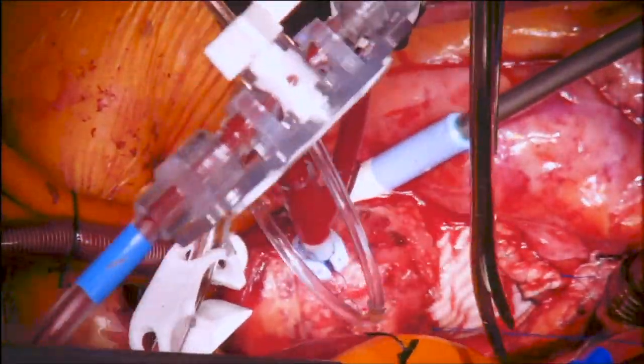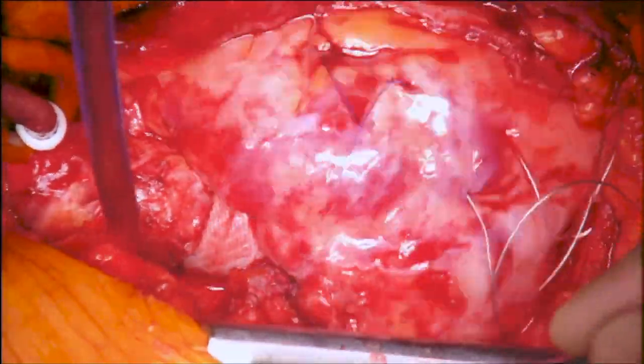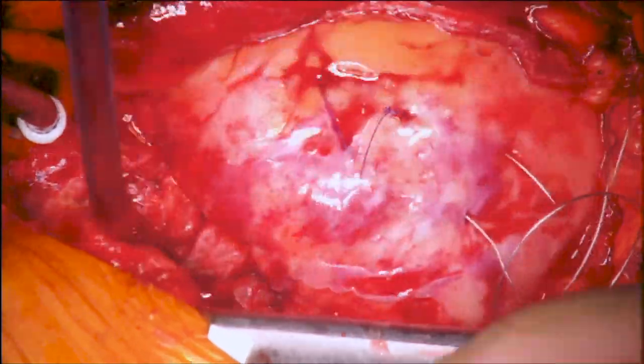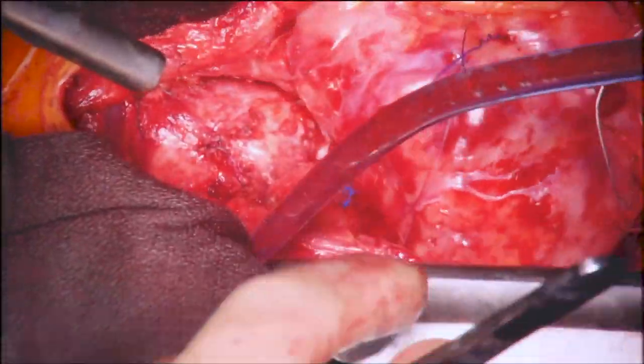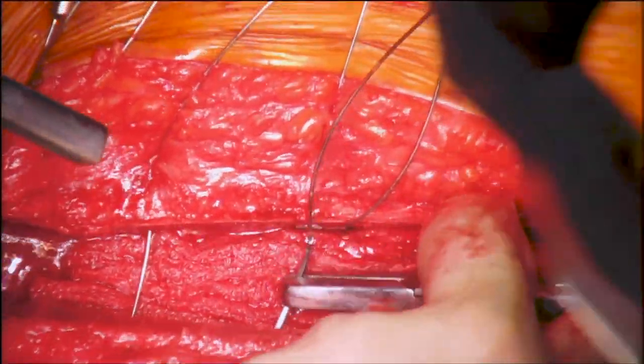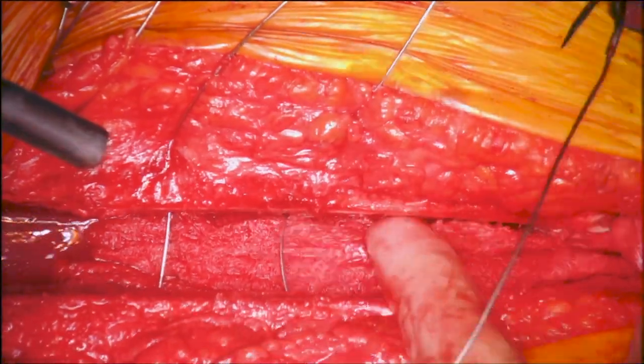After de-airing, the cross-clamp was removed. The patient was weaned from cardiopulmonary bypass. Hemostasis was achieved and routine chest closure was performed.